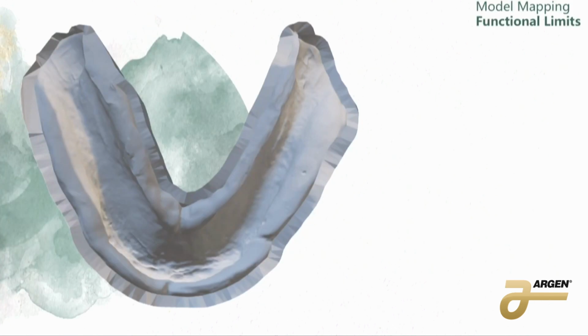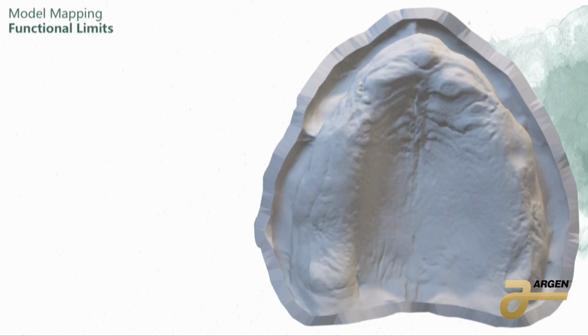So functional limits on the upper. There we go. Functional limits on the upper. So when we're talking functional limits on the upper, we're going to start with how far anterior, posterior do we set those teeth? This is assuming we do not have an accurate bite rim or an accurate reference denture. I know some of you come from lab space, and I know sometimes it's hard to get good records. Even when they're using a bite rim, maybe they're just having them bite, and they're getting the vertical dimension, but nothing else.